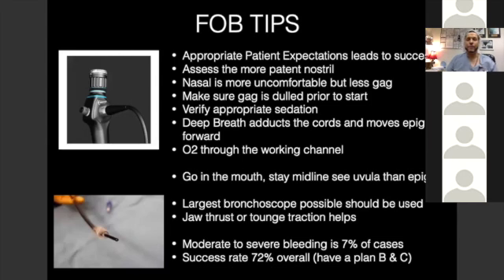Okay, fiber optic tips. You have to tell your patient what's going to happen. If you just bring them in the room and start shoving a tube down their throat, they're going to fight you. If they understand, hey, listen, you have this abscess, and if we put you to sleep the traditional way, we could have a problem breathing for you. So instead, we're going to sedate you, make you comfortable.